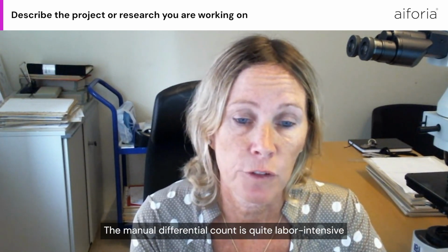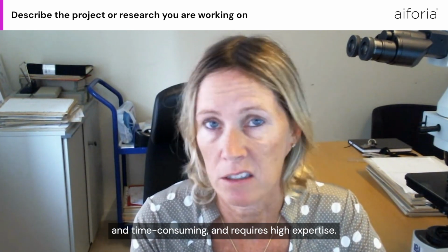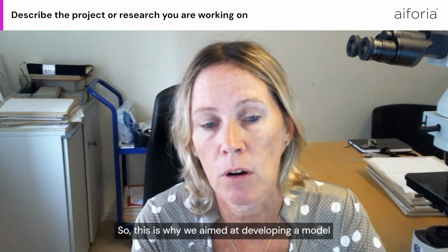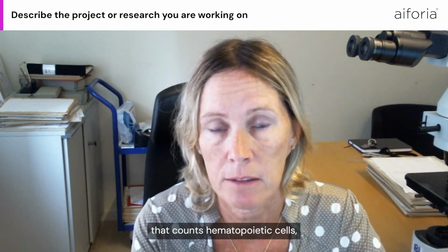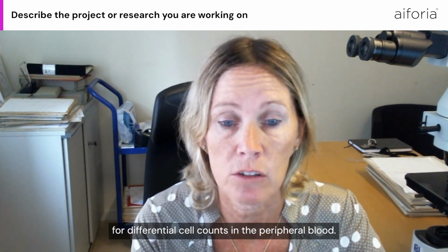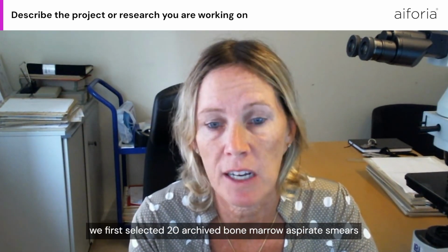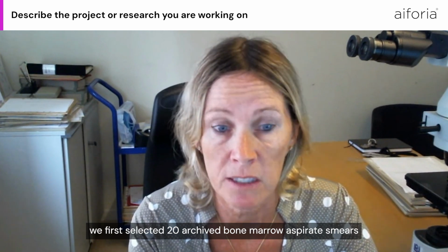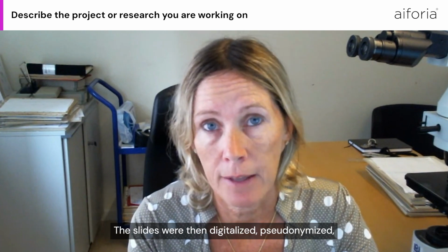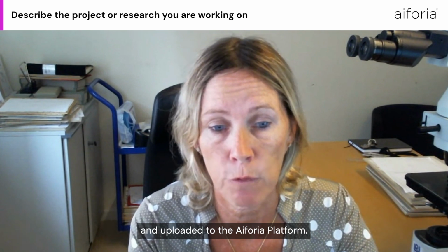The manual differential count is quite labor intensive and time consuming and requires high expertise. So this is why we aimed at developing a model that counts hematopoietic cells, similar to cell counters that are used for differential cell counts in the peripheral blood. The practical approach was that we first selected 20 archived bone marrow aspirate smears from patients with normal or reactive findings in the bone marrow, and the slides were then digitalized, pseudonymized, and uploaded to the Aiforia Create platform.